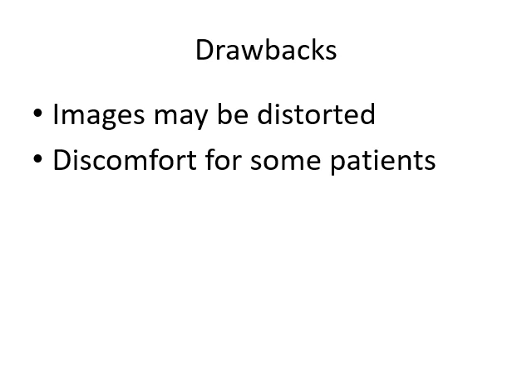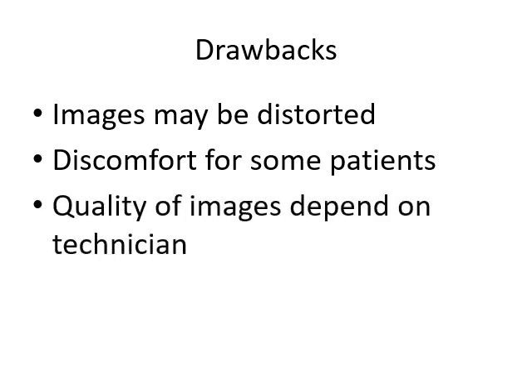And then again, for this one here, the quality of the images depends on the technician. The technicians are highly trained because they are the people who are moving the probe around, whereas with an MRI or a CAT scan, the computer does a lot of the work for you. It's kind of all pre-programmed in there. For an ultrasound, the technician really has to know what they're doing and be very careful to make sure they get a good quality image.